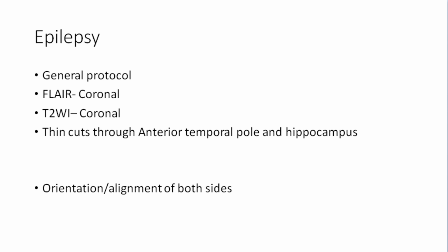Same goes for the brain. If you want the pituitary sequences, you get the pituitary sequence. We won't do everything. So that's where I'm interested. And if it's already in the system, the scan will just run it. You don't need to put the sequences in later, saying this is an epilepsy patient, we need to put these sequences in the mix as well. If it's already set, as a matter of fact, in my institution in the US, they labeled it by the name of the epileptologist who gave the sequences. So they just call it Abu Khalil's protocol. They don't mind it.